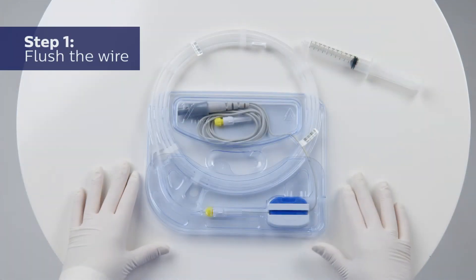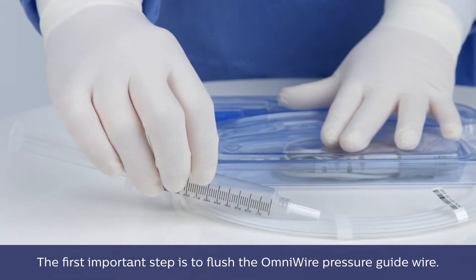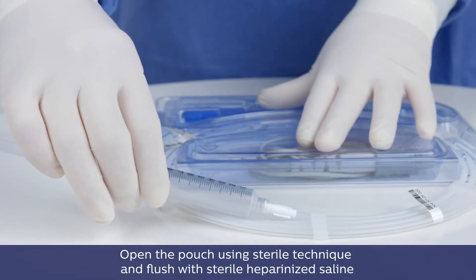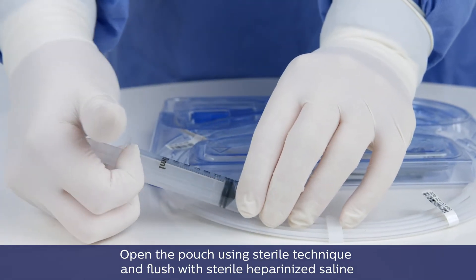Step 1: Flush the wire. The first important step is to flush the OmniWire pressure guide wire. Open the pouch using sterile technique and flush with sterile heparinized saline.